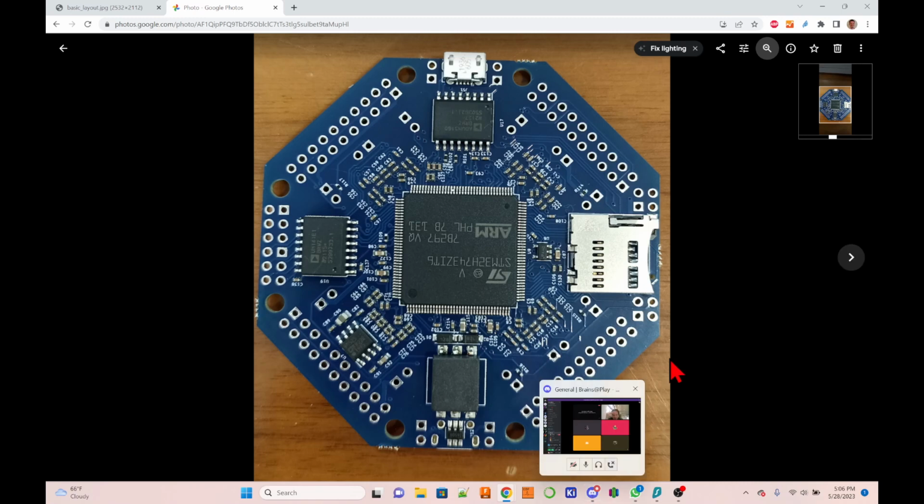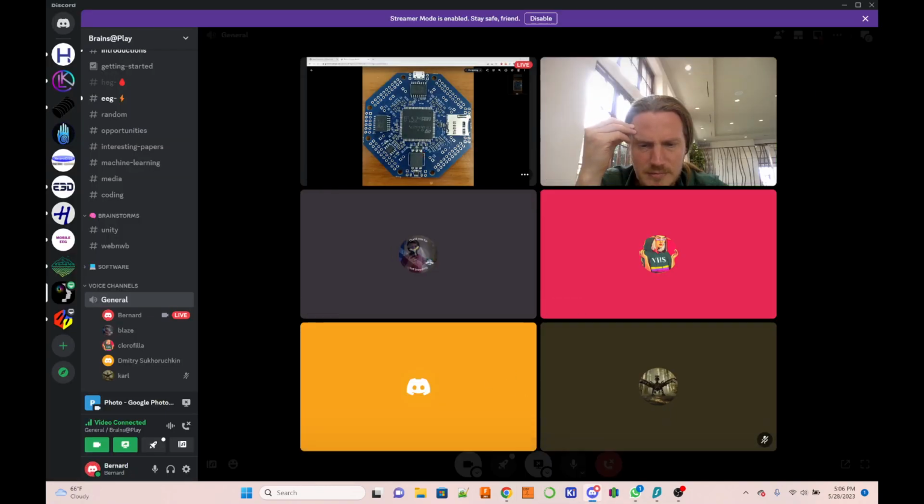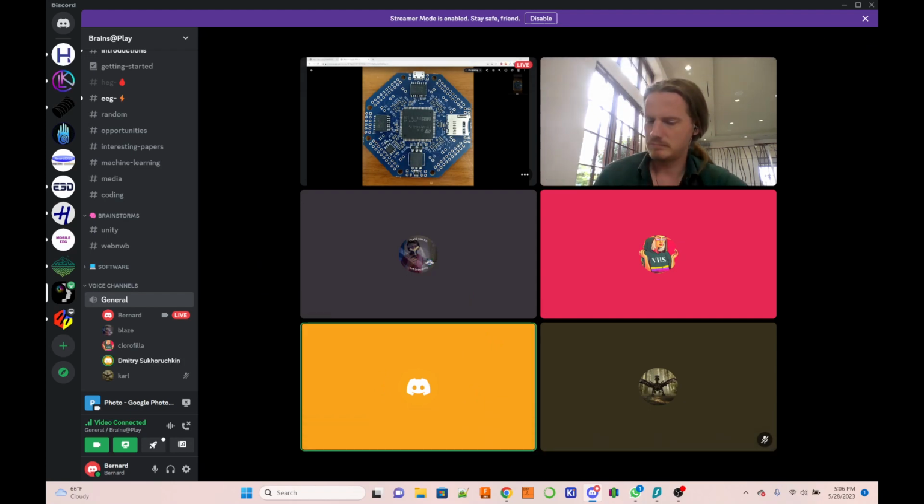And Dimitri, correct me if I'm wrong, but I believe that the resistors should be removed on every single board. Like within the system of interconnected boards, there's not a single board that needs to have these, right? Like they need to be removed on every single board. Is that correct? Can you confirm? Yes, you need to remove all these 0 ohm resistors. Yeah, on every board within the system.